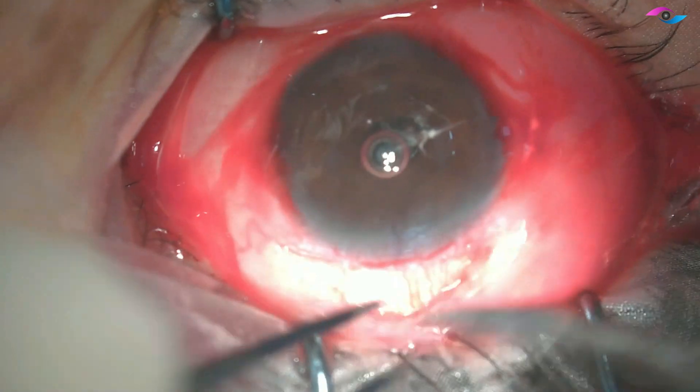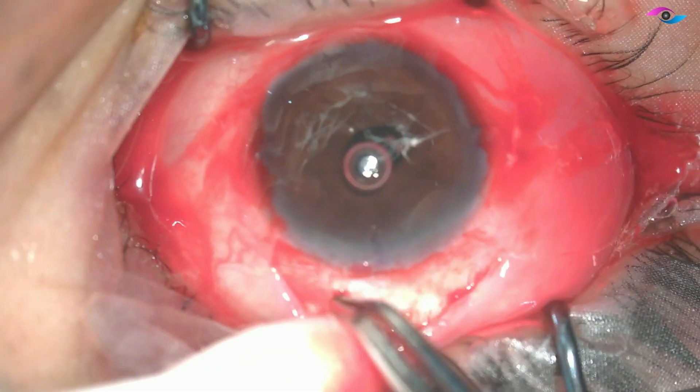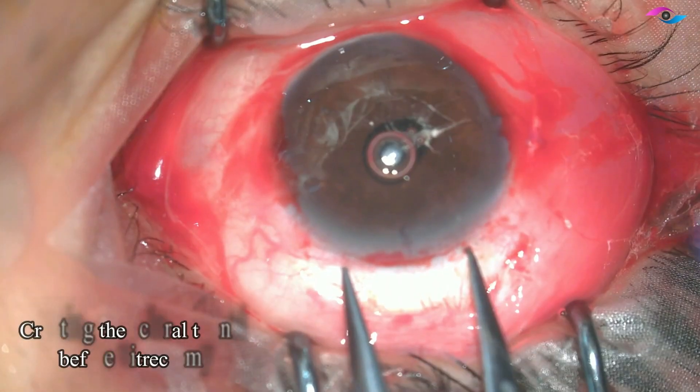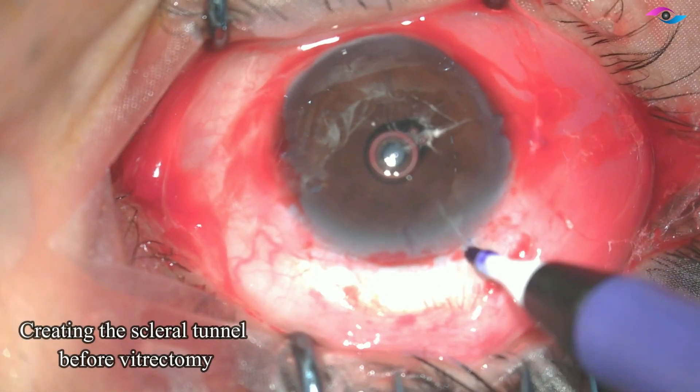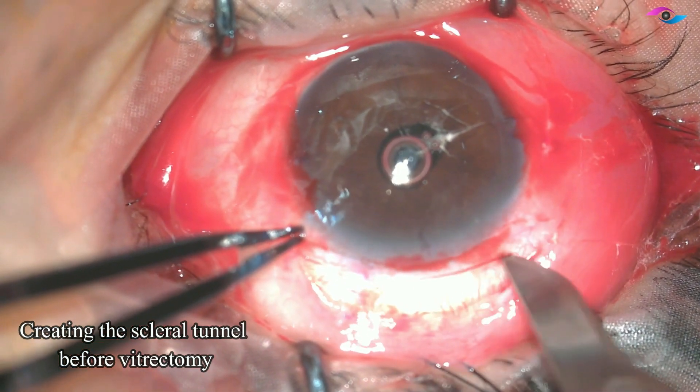Before I go ahead with the vitrectomy, I decide to make the scleral incision first — that is the main incision from where we are going to insert the IOL. I have done a conjunctival peritomy and I am measuring a 6 mm incision, then using a number 15 blade to make the initial scleral incision.